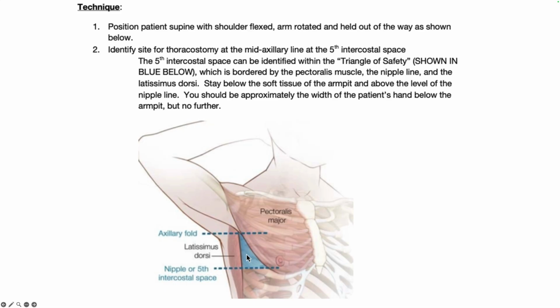In most patients, you're actually going to be able to feel the chest wall pretty well there. Even obese patients don't have very much fatty tissue in that space, and even a big muscular patient, there's no muscles over that. That's going to be very close to the ribs in the chest wall.